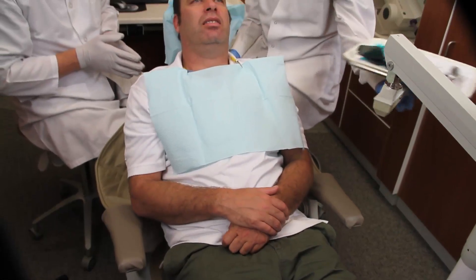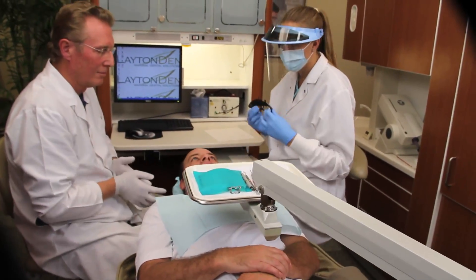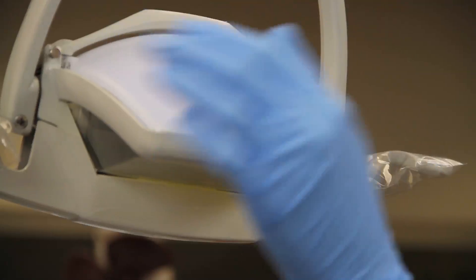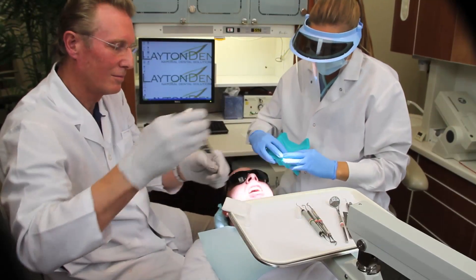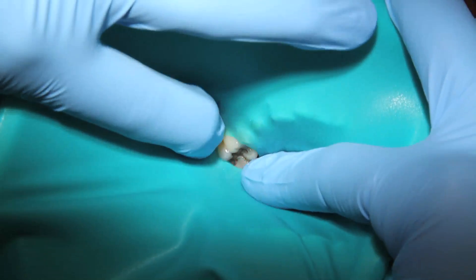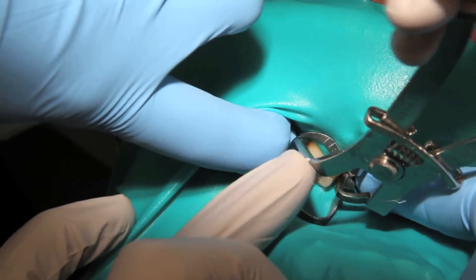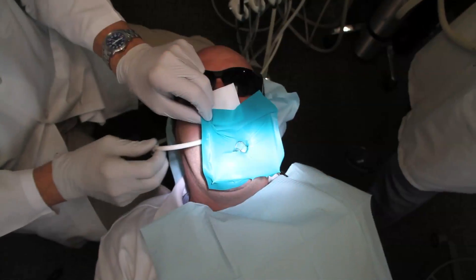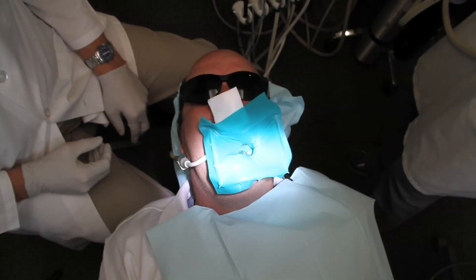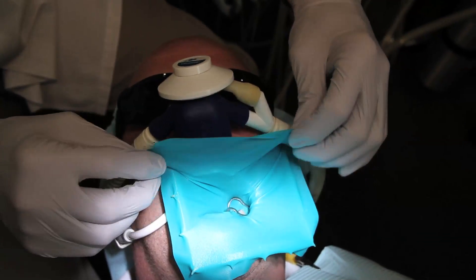When Eric is comfortable, we'll sit the chair back and prepare him for the mercury removal. First, the safety glasses. To prepare for safe mercury removal, we shield the patient by isolating the tooth. After anesthesia, you can see the placement of an elastic shield that isolates the tooth and keeps the mercury, water, and gases out of the mouth. For your comfort, we place a small suction in the mouth to remove the saliva. The patient will be made as comfortable as possible with a gauze over the nose for easy breathing, or a forced air or oxygen nose cover, whichever you prefer.